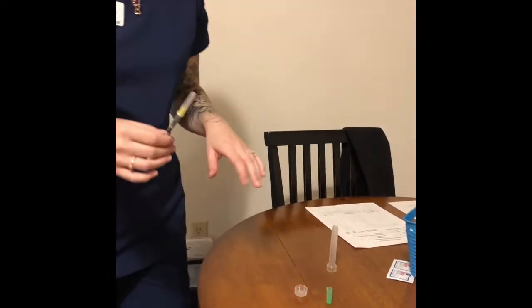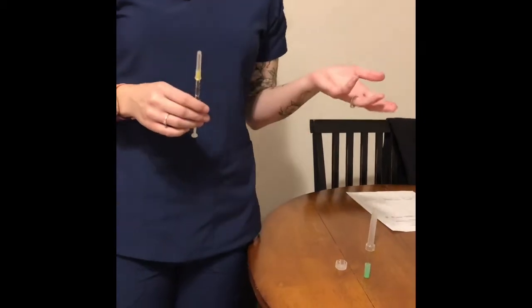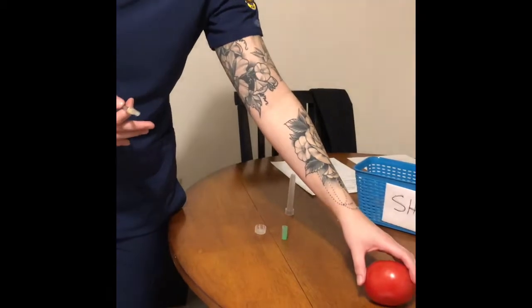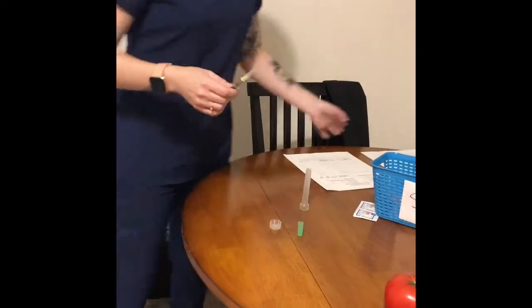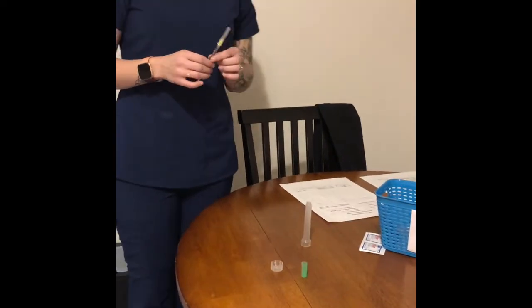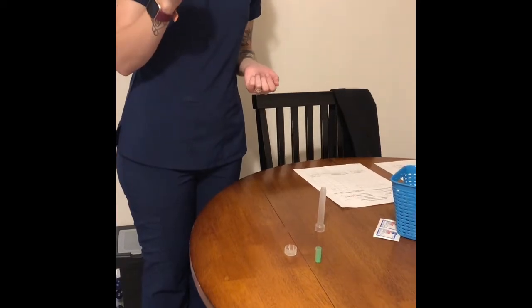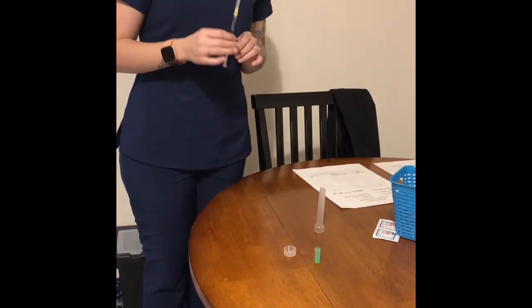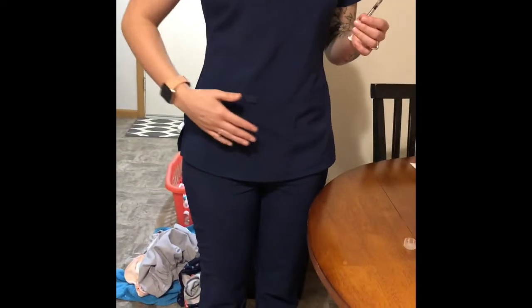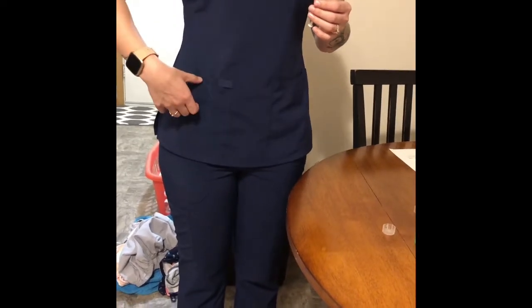So I'm going to enter the room. I'm going to introduce myself. Hi, I'm Abby. I'm going to be your nurse today. I'm going to look for 2 patient identifiers. I'm going to look at their wristband and ask them their name and date of birth. I'm going to go into their medication administration record, and I'm going to check for allergies. And I'm going to check that I have the right medication, heparin, with the right dose, the right time, and the right route. So for heparin shots, you want to do it in the abdomen, the lower abdomen. It's subcutaneous, so you want to get the fat down there.